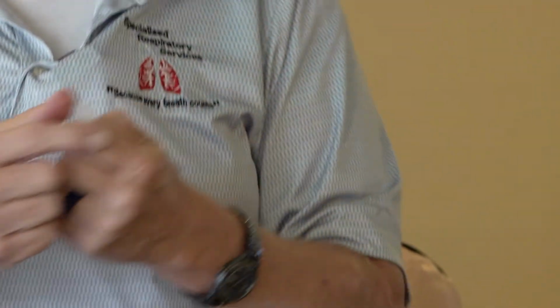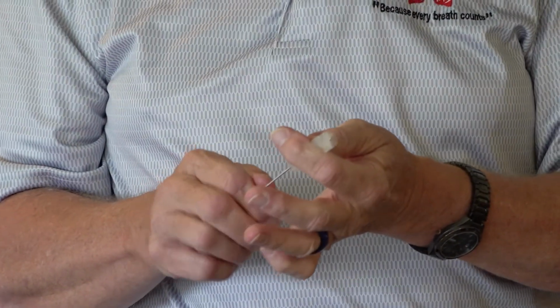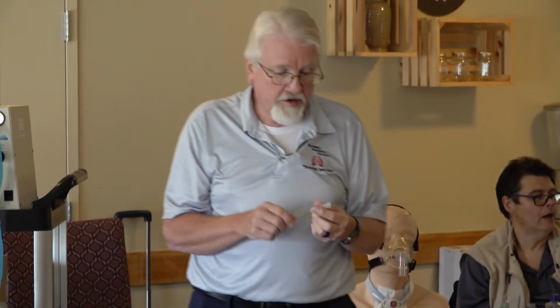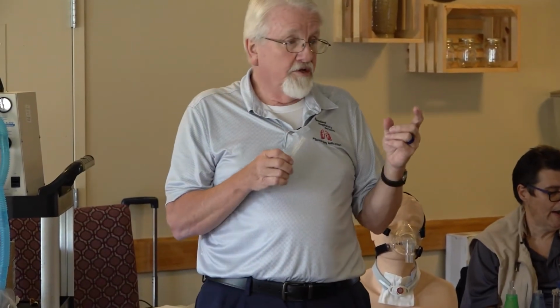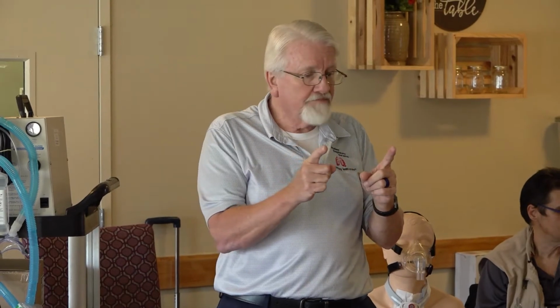Okay, and then at the end of the bristles is going to be a plastic collar molded onto your brush, so that way you can't go in too far. Again, this is designed for the TEP that patient has in it. Okay, and the other little piece of equipment you're going to get is going to be a plunger.